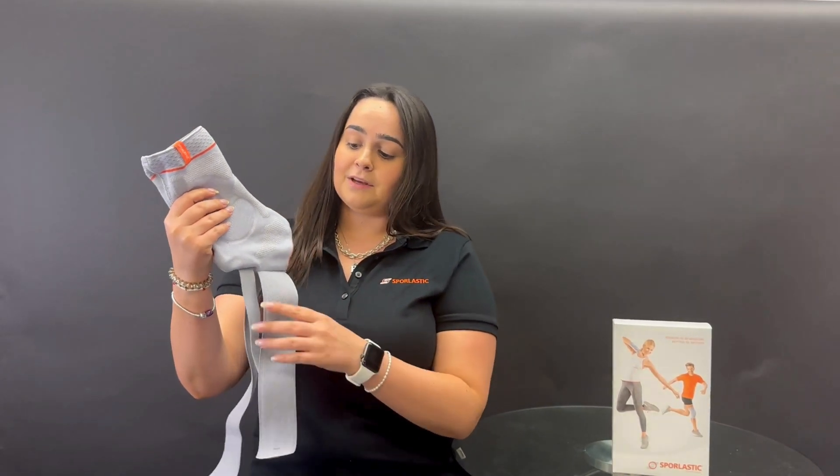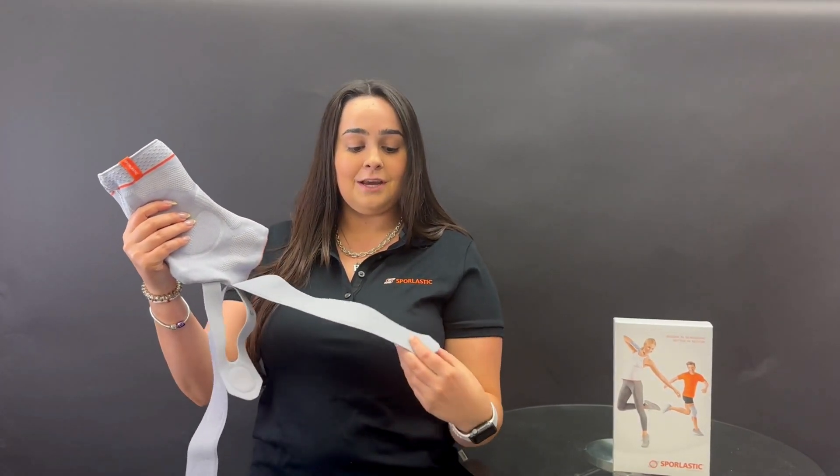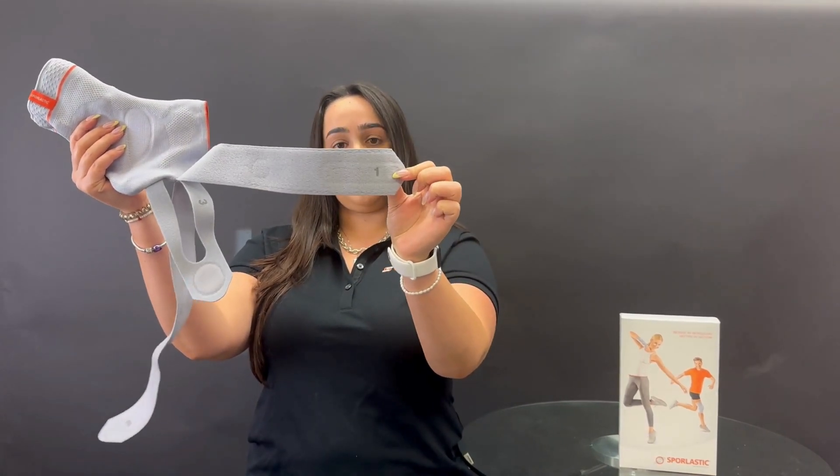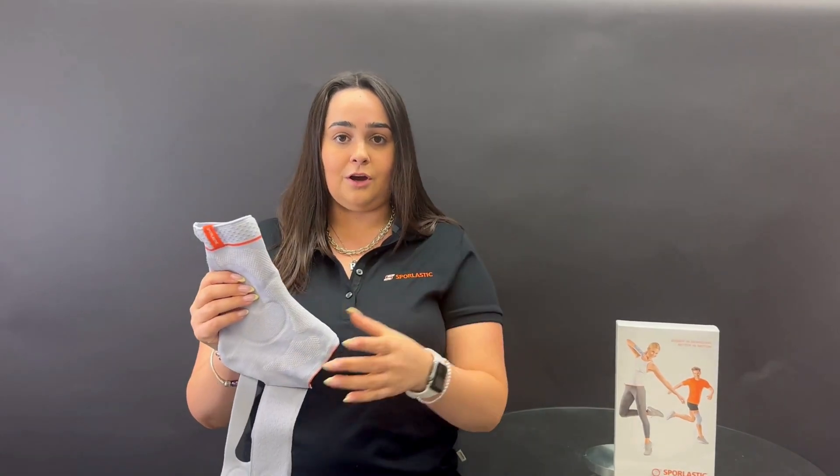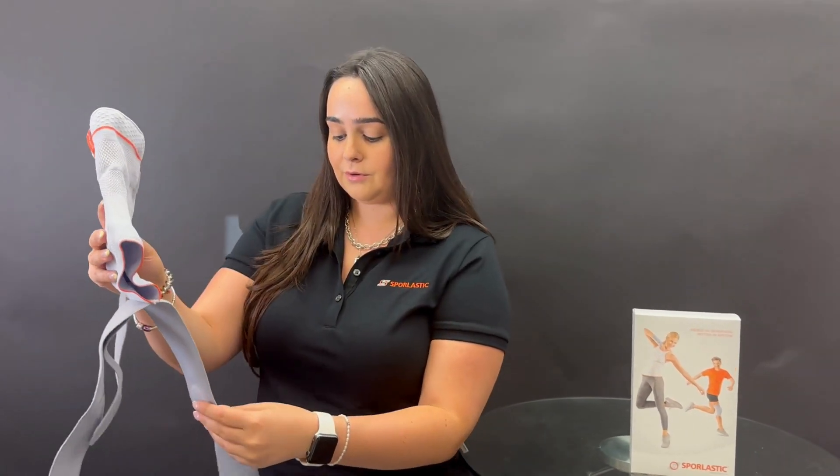When you look at the straps it can be a little confusing at first, but Sporlastic actually numbered all of these straps so that you know which order to put them on in. I will go over it with you today.